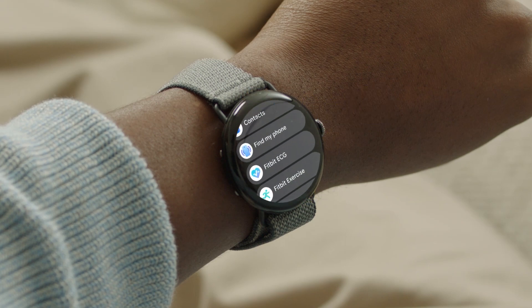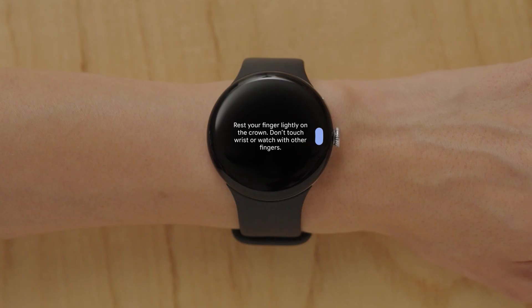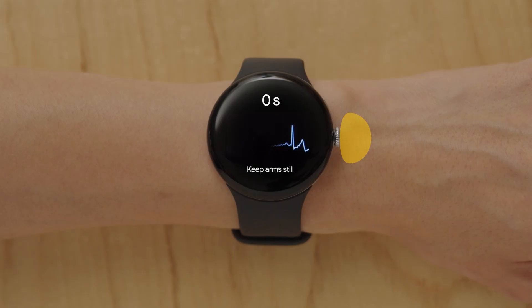Open the ECG app on your watch, then select the wrist your watch is on. Take one finger and lightly rest it on the crown, making sure your other fingers don't touch your hand or the watch. Hold your finger still during the countdown. When it's finished, remove your finger from the crown.